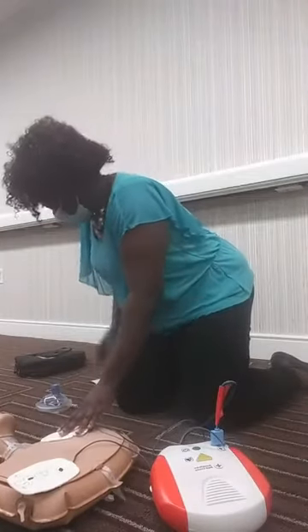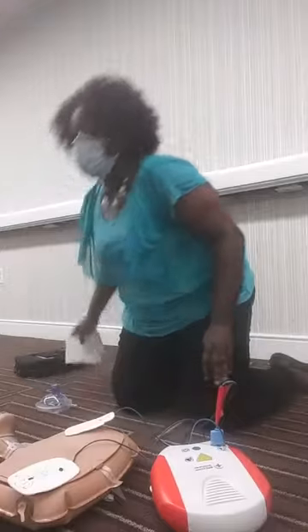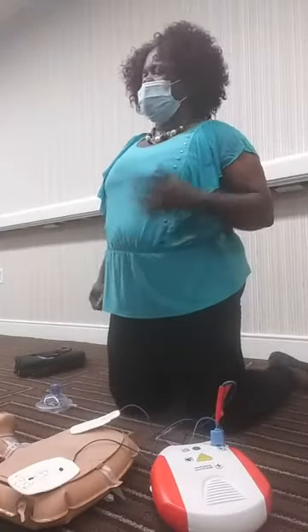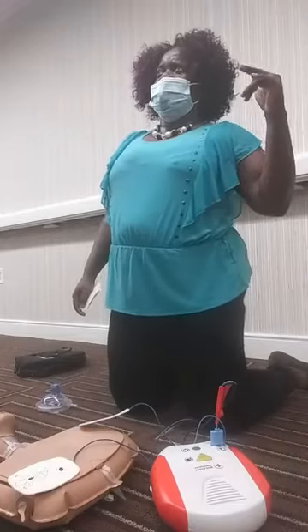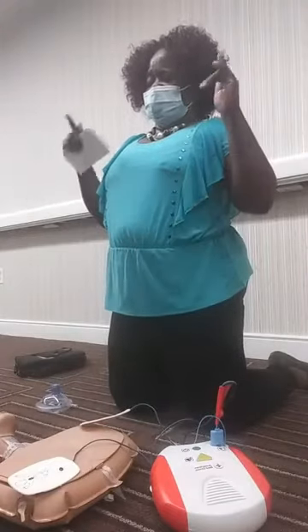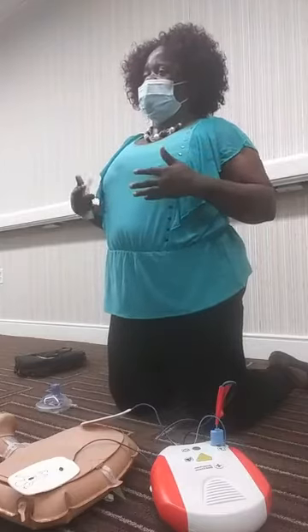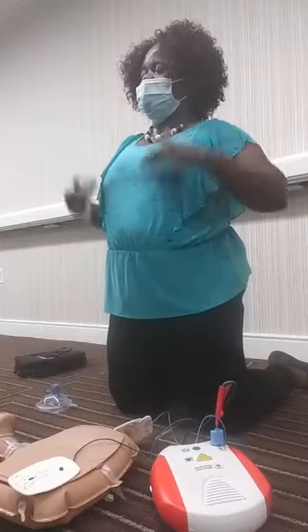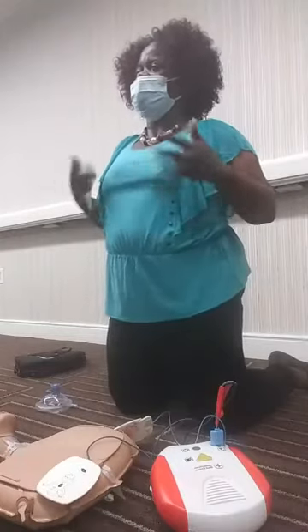There are a few considerations with the AED. First, it is safe to use on a pregnant lady. Also, if a victim has been submerged in water, you do want to get them out of the water and dry out the chest area, because water and electricity don't mix and it can interfere with delivering the shock.